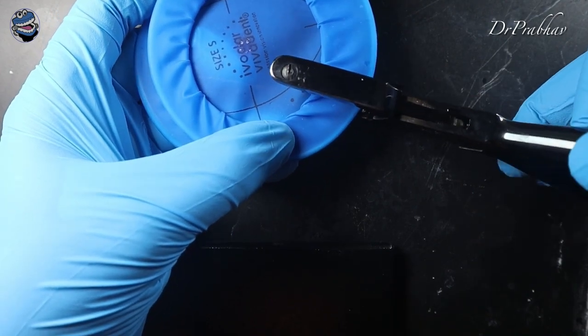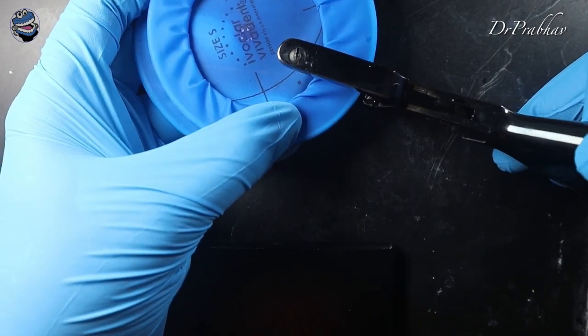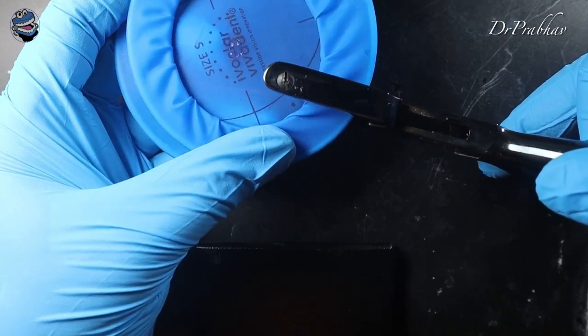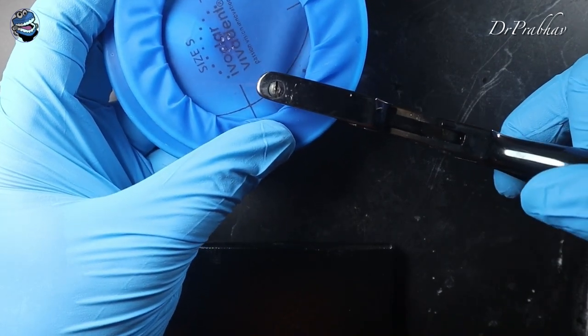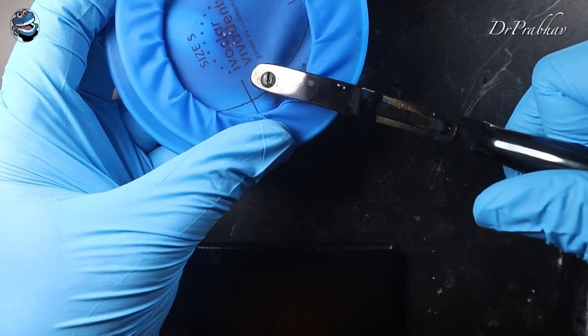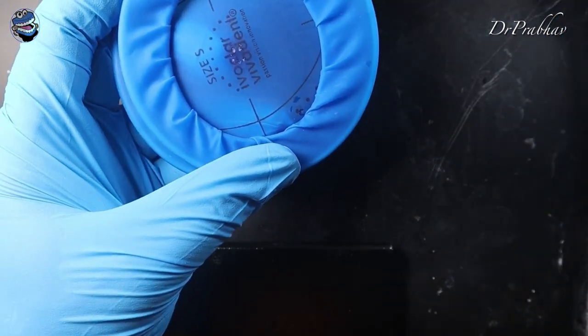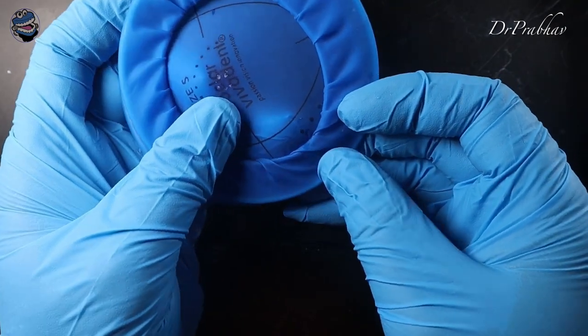We punched the hole for the molar over here, the right mandibular molar that we need to treat for this dummy patient. Now I think that he will be able to get his treatment done with the help of this OptraDam thing. We punched a hole and there was a hole over here.